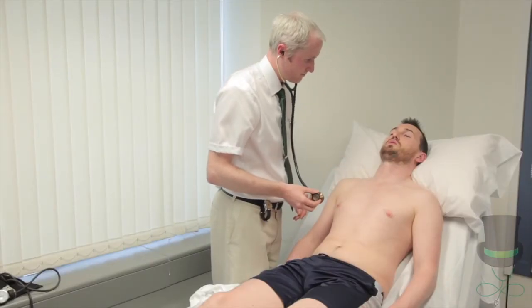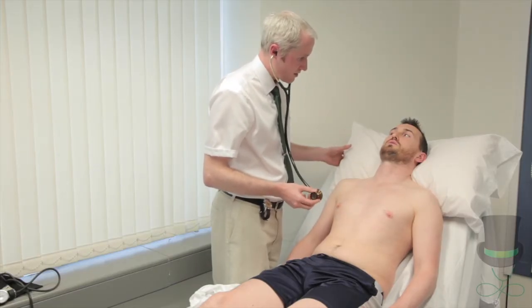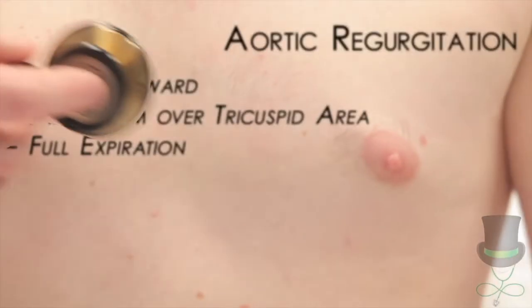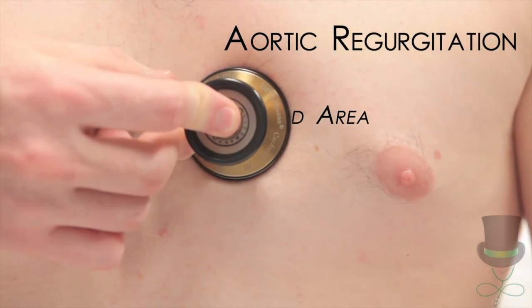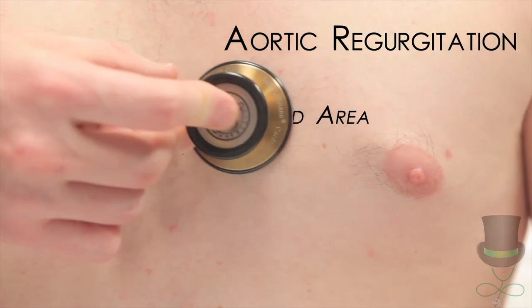Okay, you can catch your breath. I need you to do it one more time, but this time I want you to sit forward. For aortic regurgitation, ask the patient to sit forward and listen over the left lower sternal border with the diaphragm in full expiration.